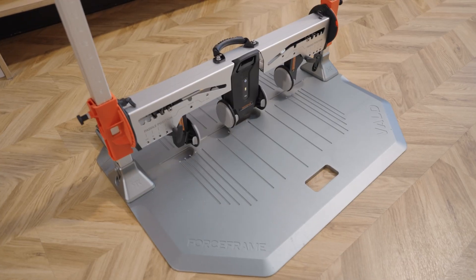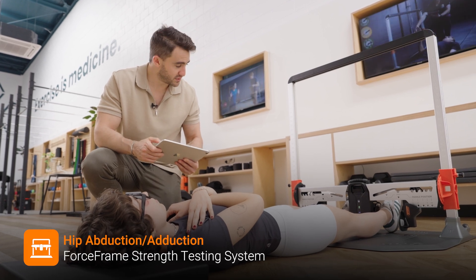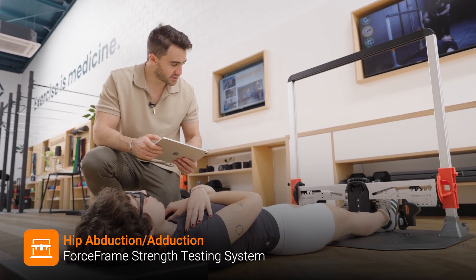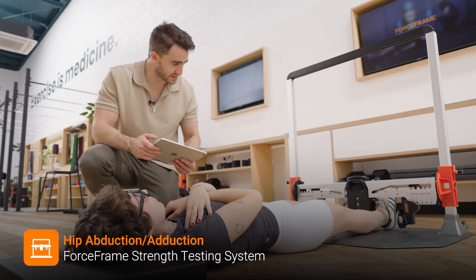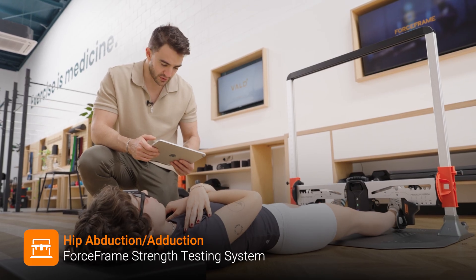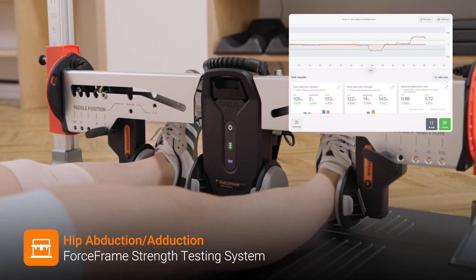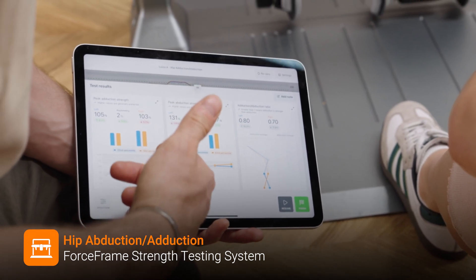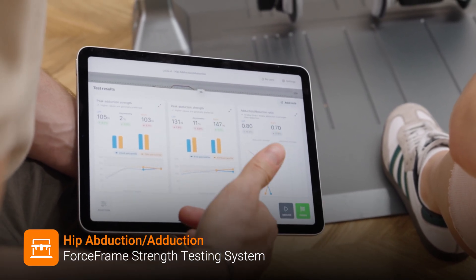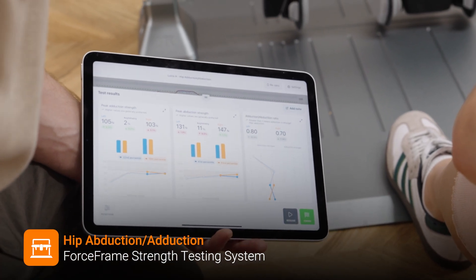Now we're going to use the ForceFrame to assess the strength of Louisa's hip muscles, which are important for stabilizing the knee. Louisa performs adduction squeezing the inner paddles, then abduction pushing the outer paddles. Her injured side has improved in adduction and her symmetry in adduction has improved; however, her injured side has gotten a little worse in abduction and so has the asymmetry, so those are some things we'll need to work on.